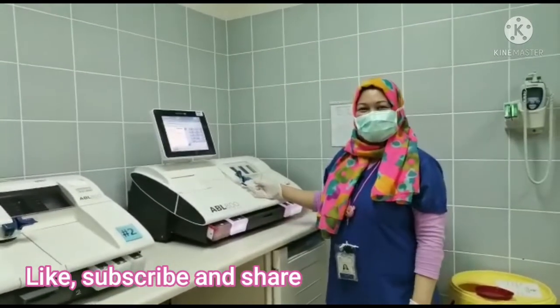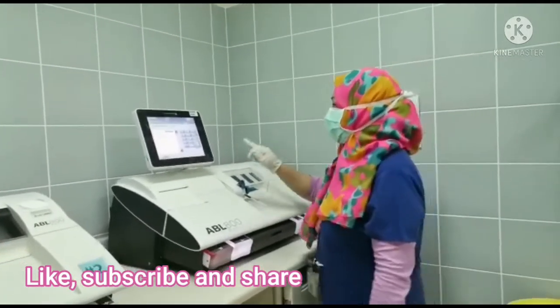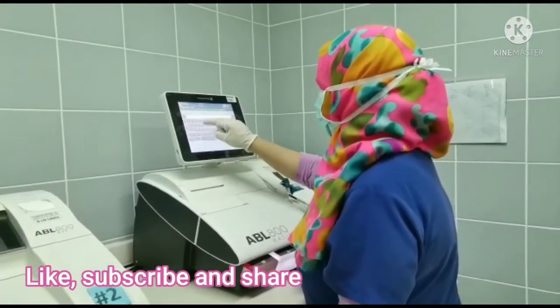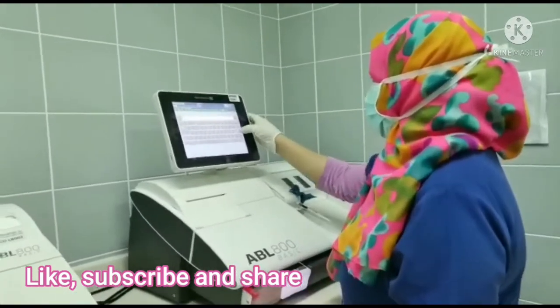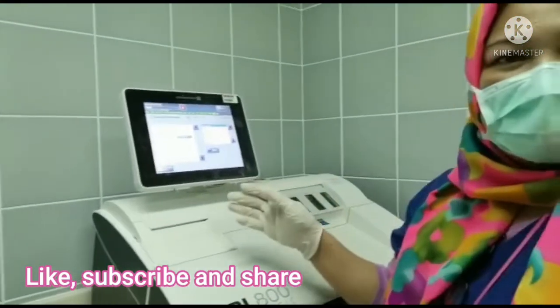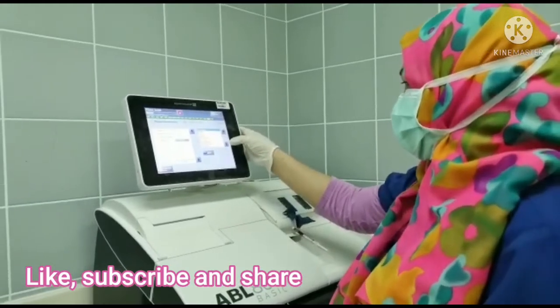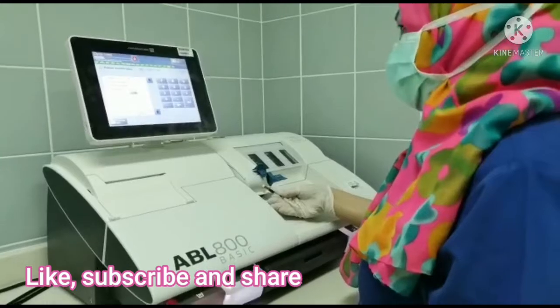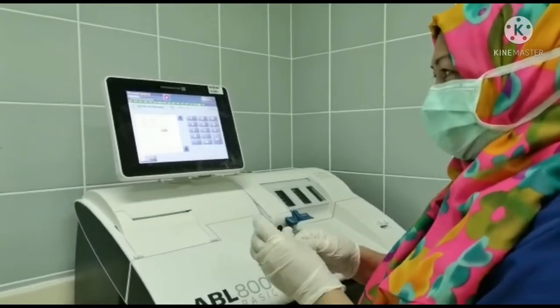So this is how we are going to do the blood gas, guys. You have to fill the sample here and it will aspirate, and you have to enter the patient's ID. For example, I don't know the name of the patient, so I will write the bed. Then enter. Then you have to specify the sample, if the sample is capillary, venous, or arterial. Then after that, you have to remove the sample and wait for the result.